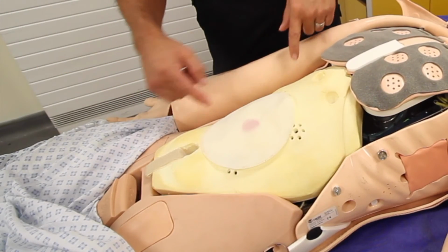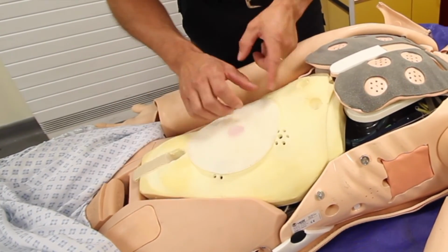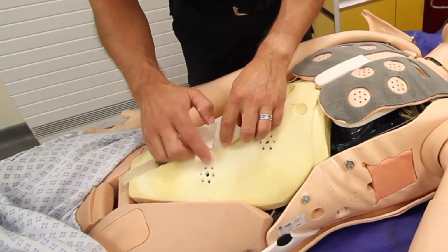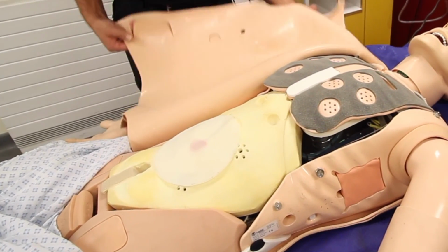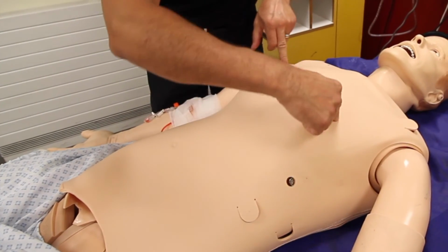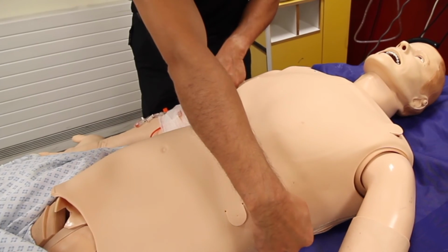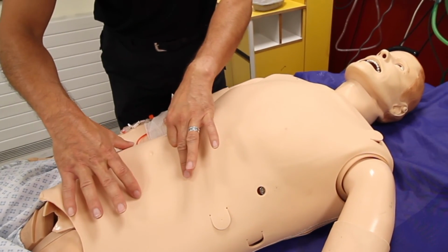Since we've got the skin off here, if you look back on his tummy here, as I was talking about those 4 quadrants, you can see that the speakers are just in these areas here. So that's roughly where you're looking. So I'm just going to pop the skin back over again so you can try and map those. So air entry about here into the bases, heart sounds here, and then up on there, and these bowel sounds just in there.